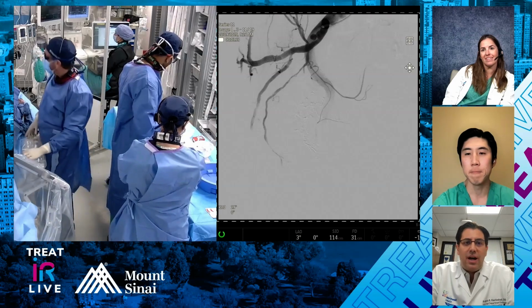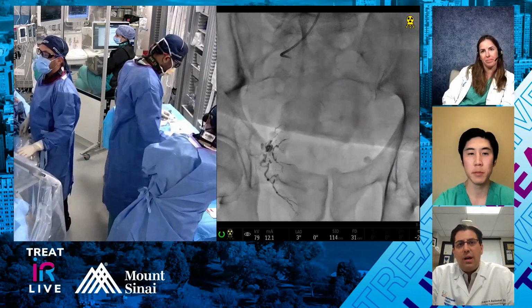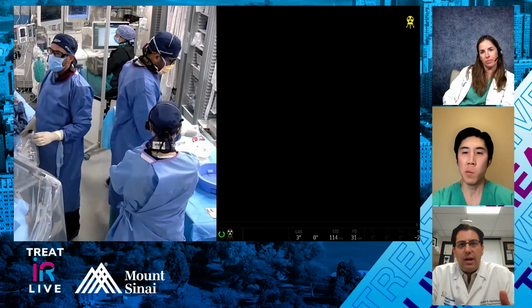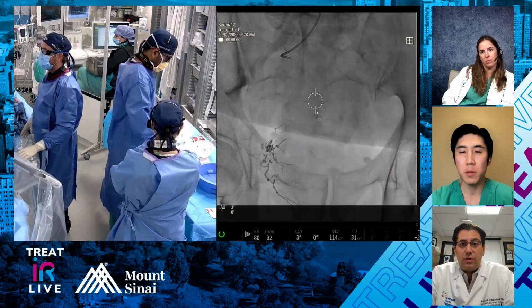Art, you want to talk about that? Fischman and I work together. We have a scoring system that the deeper you are, if you get to the middle, it's like a grade 3, and that shows us those patients actually do better over time. We looked at this out to a year.